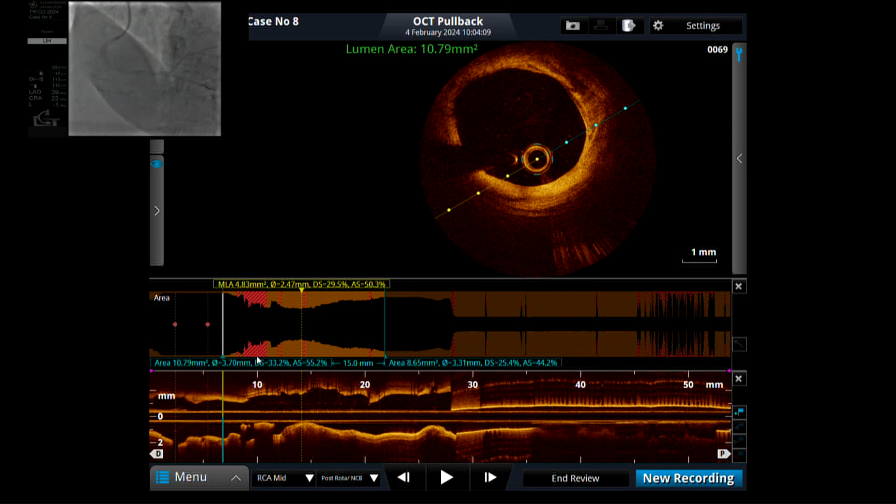So Tejas, let me ask you, going into this with OCT now, do you have in your mind criteria that will make you post-dilate? I will just see and then I will give my comment, because sometimes it may be a little bit different from the criteria decided in OCT.